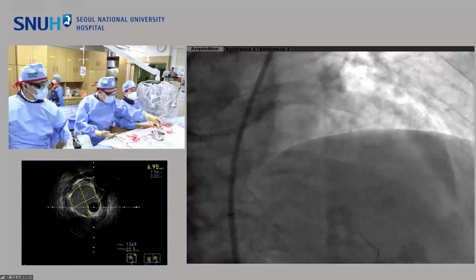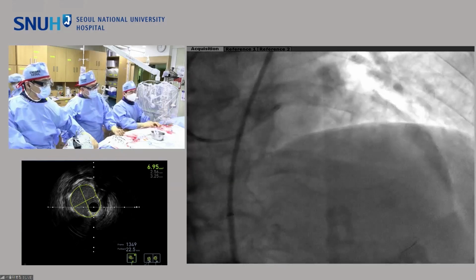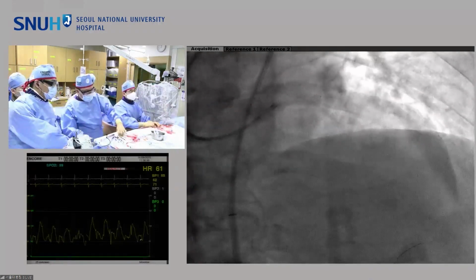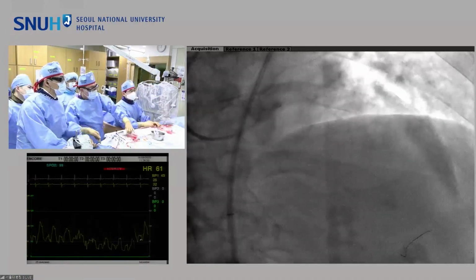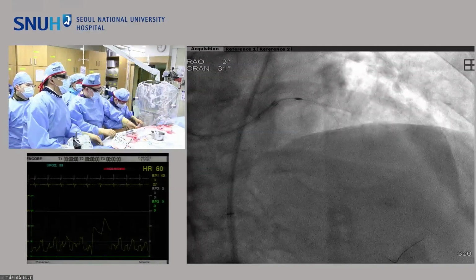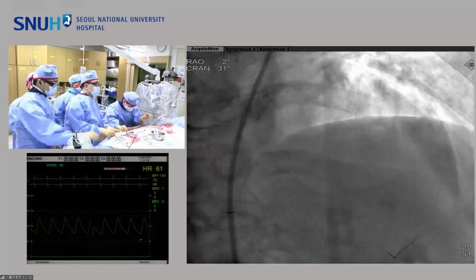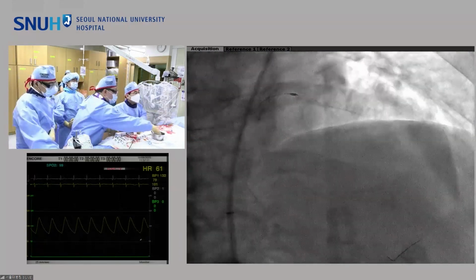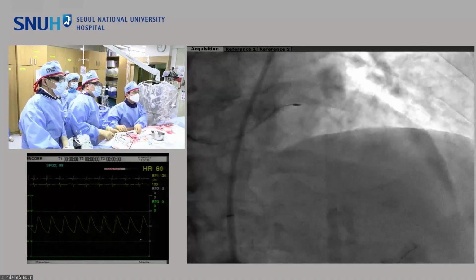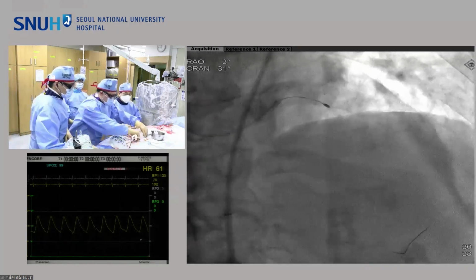What size burr do you have now? 1.5. Good. Is that 1.5? Is that the Rota? 1.25? Okay. 1.5. 1.5? Okay. Yeah, to save the number of Rota. Looks smaller. Yeah, it does. But it's oval. Yeah, it's oval. The 1.25 is almost like a tube. I forgot to do intracoronary infusion of atropine.